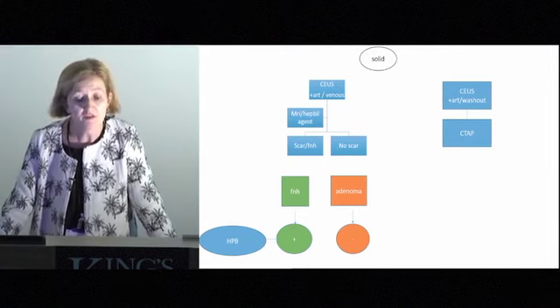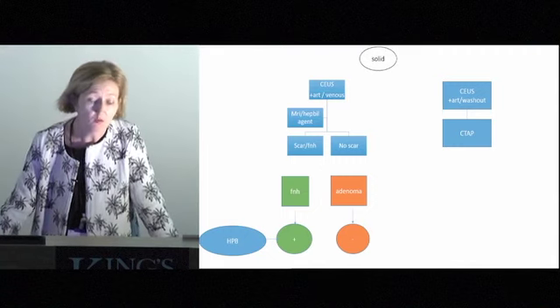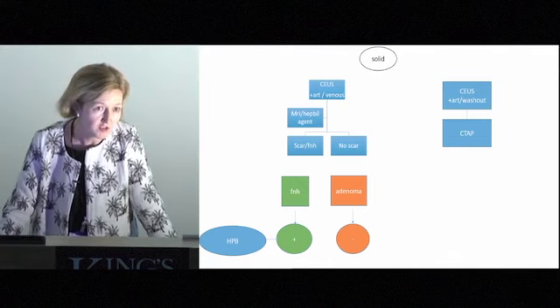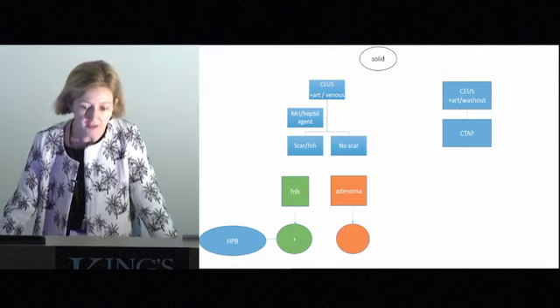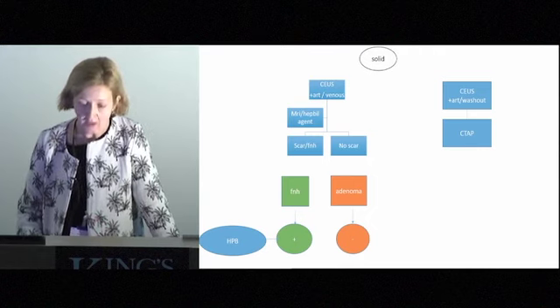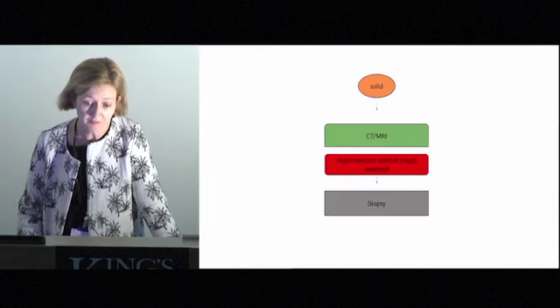What happens if we see a solid lesion? We can't be quite so sure. We'll have a well patient in front of us. We'll think it probably is a metastasis. So if we give contrast ultrasound, it will help us to triage the patient and their follow-up. If we give contrast ultrasound and it shows enhancement on the arterial and venous phase, it's more likely to be benign. And if it shows washout in the venous phase, as we've heard, it's more likely to be malignant.